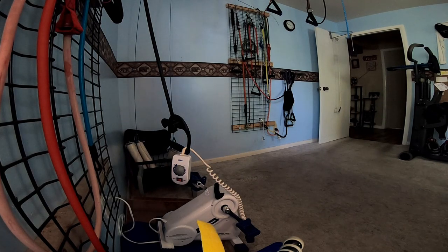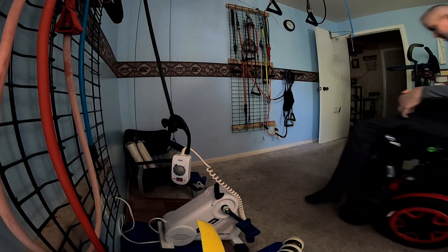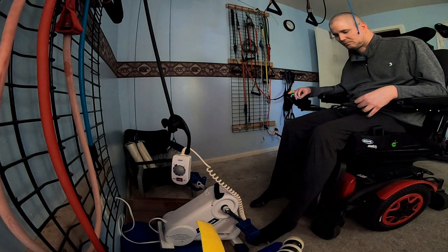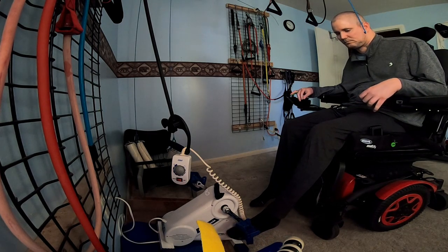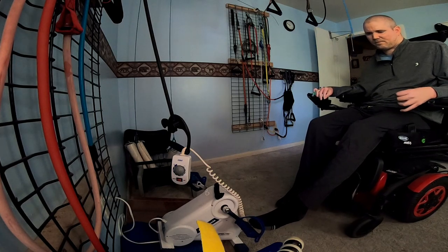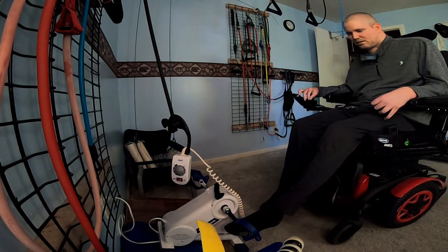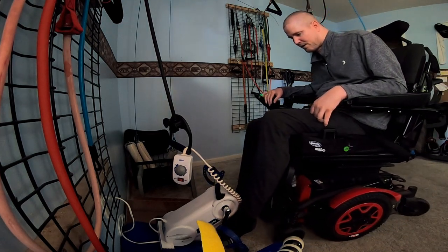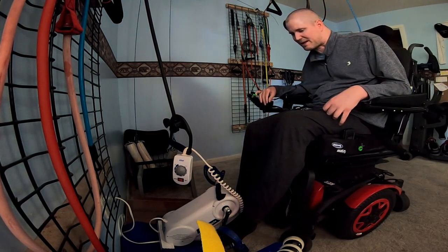So let's put my feet — my left foot in again so you can see better. Oh, I put my right foot in. Left foot in, usually not much of a problem.